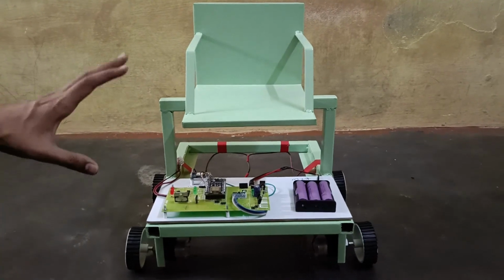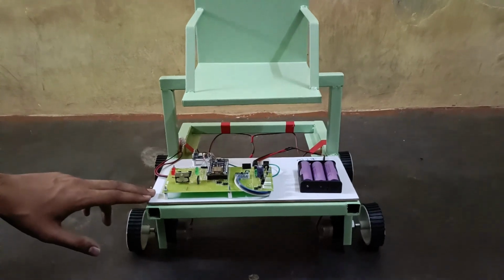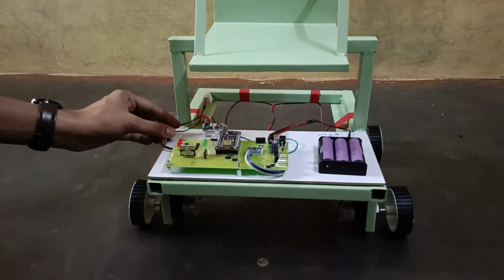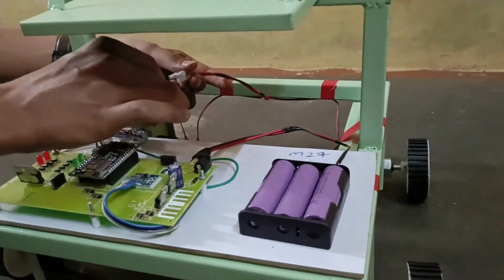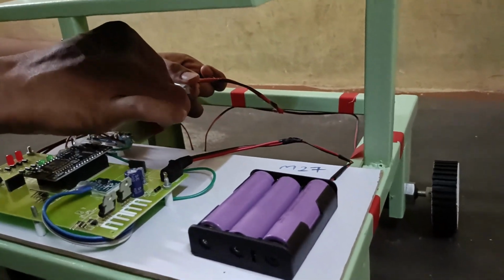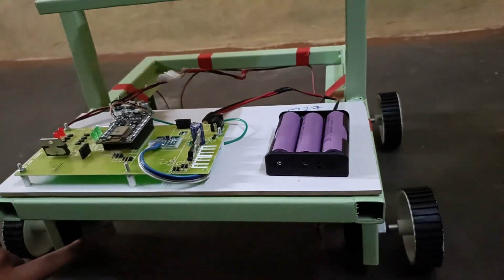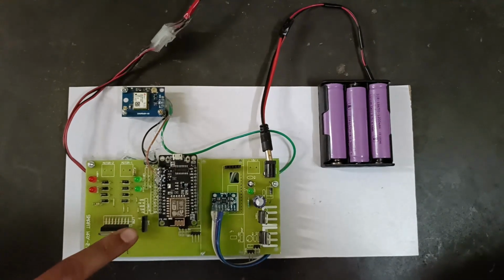Here we can see the prototype model. It is a wheelchair prototype model and the receiving section of the project. The receiving section is connected to the wheelchair through connector wires. It is connected from the L298N motor driver to the 30 RPM motors, which are connected to the wheels. This is the receiving section unit.